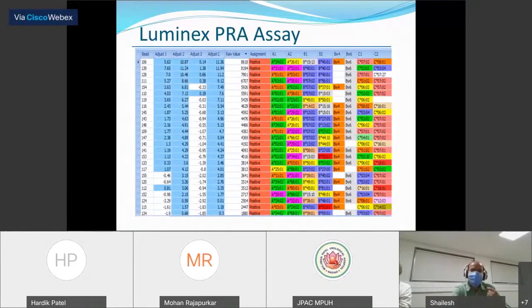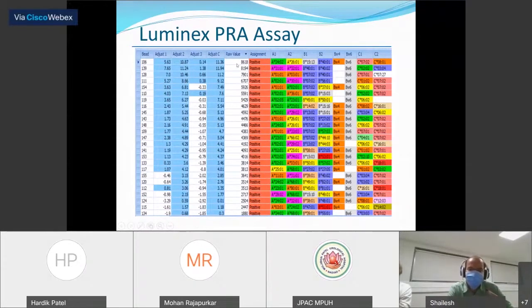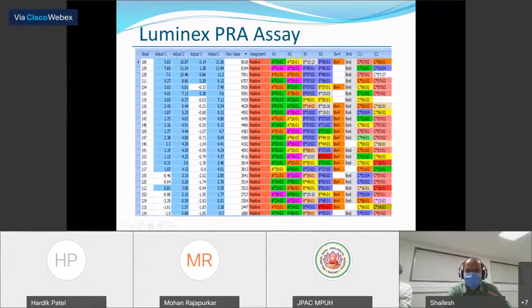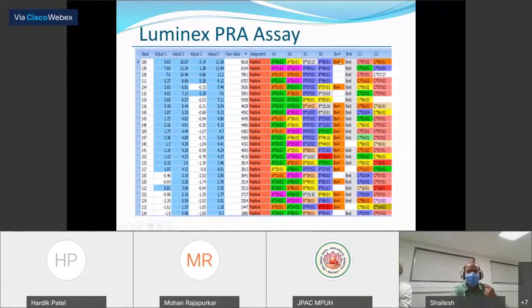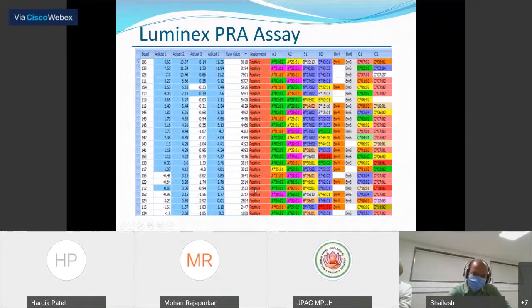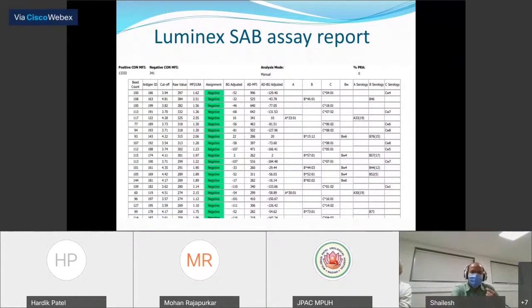Looking at the machine-generated report of a PRA assay — for example bead number 106, the MFI is 8600 and it's positive. The list shows the complete class 1 phenotype of an individual present on this bead. We know the antibody is reacting against this bead, but we cannot pinpoint against which specific antigen the reaction has taken place. Based on the percentage of beads against which the antibody has reacted, it gives us the percentage PRA value.